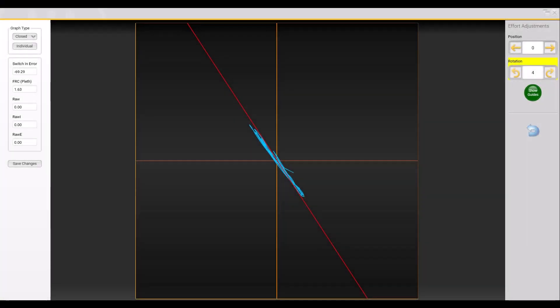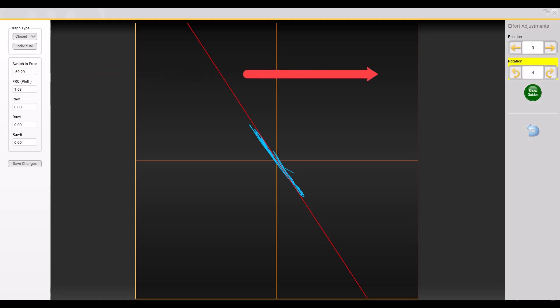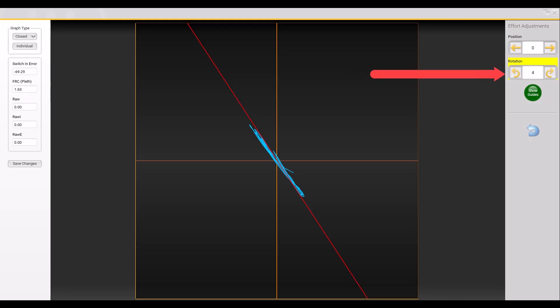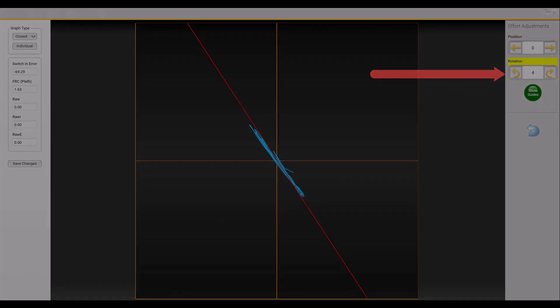Most of the time no adjustment is needed on the closed or lung volume tracing. However, if there was a leak during closed shutter panting, the computer will use those data points and skew the line of best fit. When this happens, you can manually adjust the line of best fit and ignore the data points caused by the leak, by using the rotation adjustment arrows in the upper right of the screen to rotate the line of best fit to ensure a proper angle.